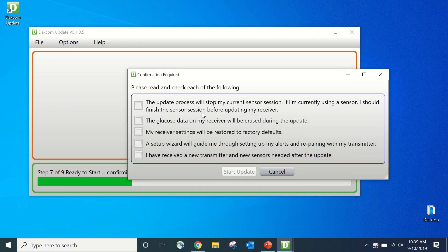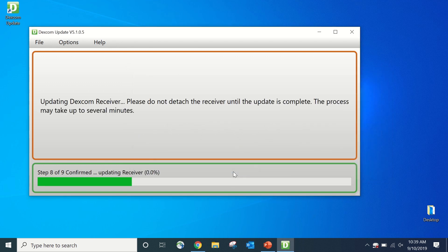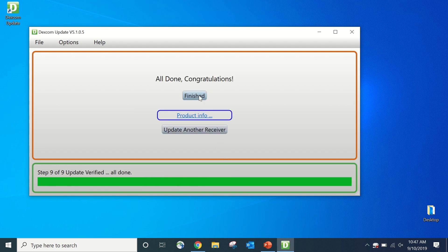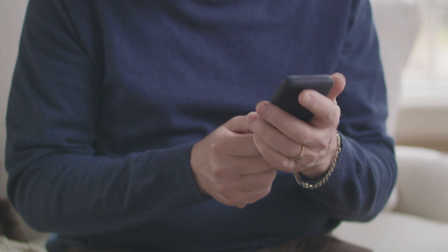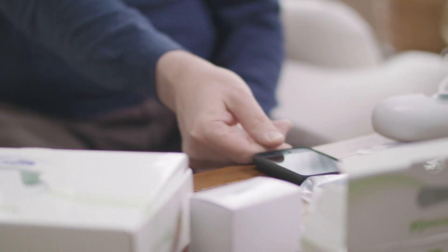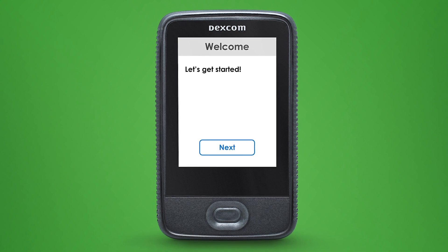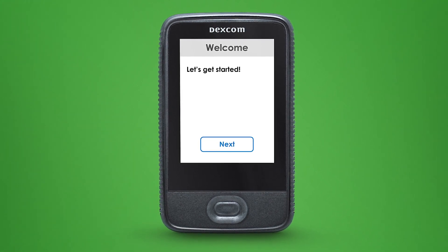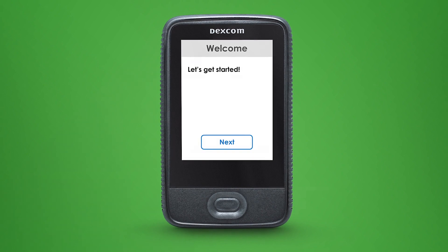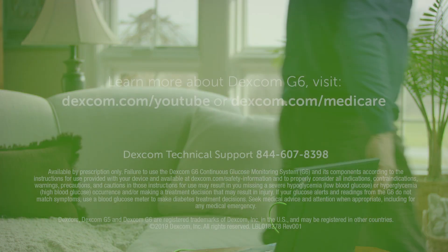A window will pop up for you to review and check each statement before you can select Start Update. After about 10 minutes the update will be complete. Select Finished and you can now detach your receiver from the charger cable. You have successfully updated your touchscreen receiver to the Dexcom G6. Your receiver will reboot, so follow the instructions in the setup wizard on your receiver to pair it with your Dexcom G6 transmitter and to set your alert settings as if it's a brand new receiver.